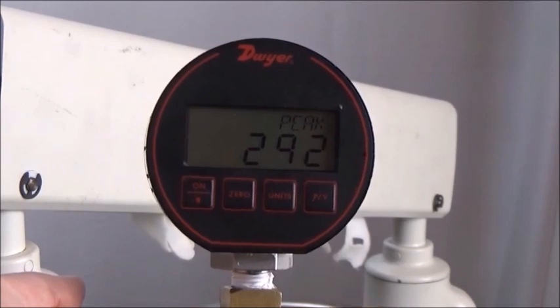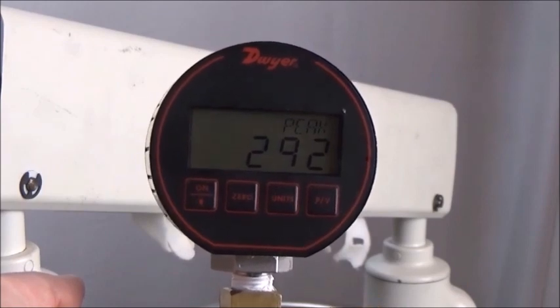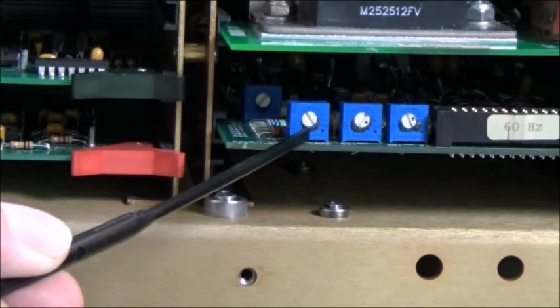The pressure should be 300 psi plus or minus 30. If necessary, adjust R83 on the PDC board and repeat.